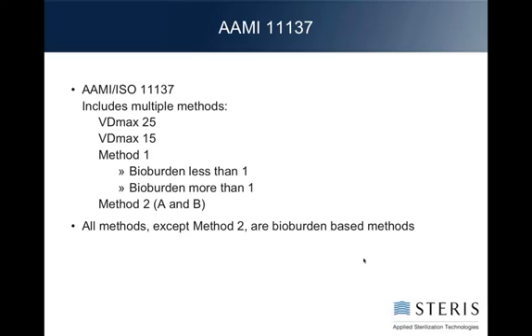All of these methods that we're going to talk about today, with the exception of method 2, are all going to directly be based on bioburden. You're going to hear bioburden referenced over and over again because it is the critical factor in a lot of these. For setting the right dose, for controlling your sterilization process, it's all about the bioburden.